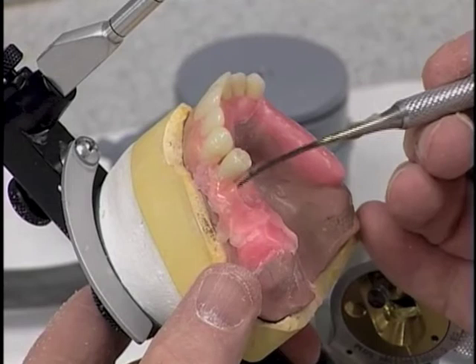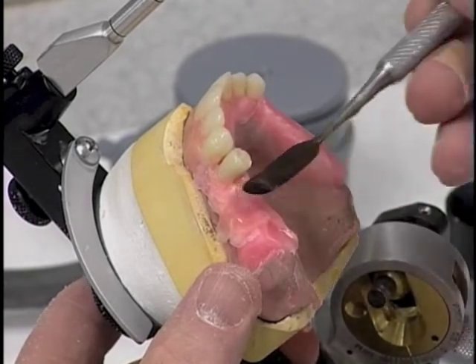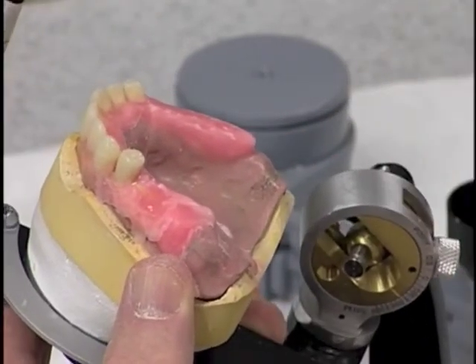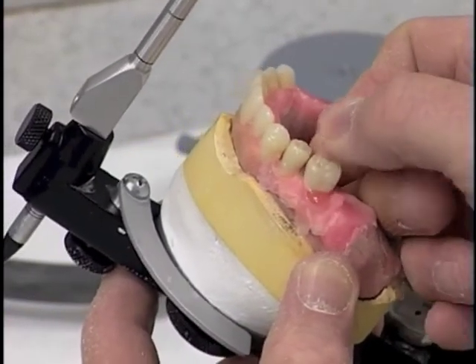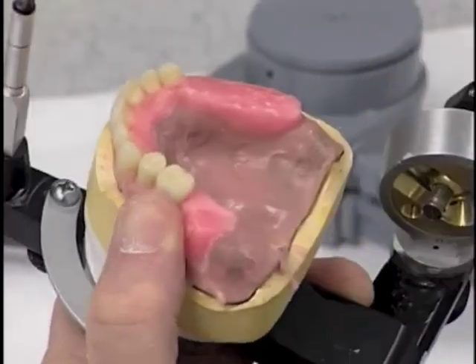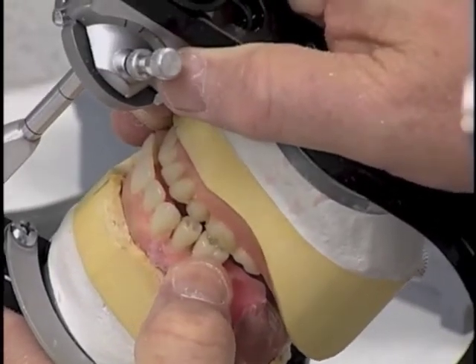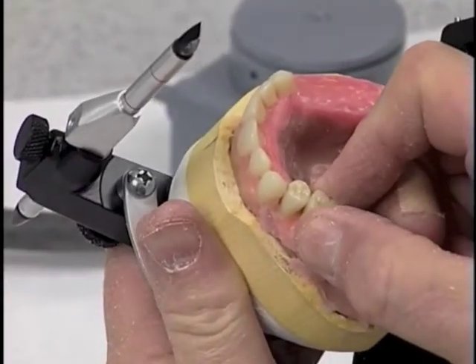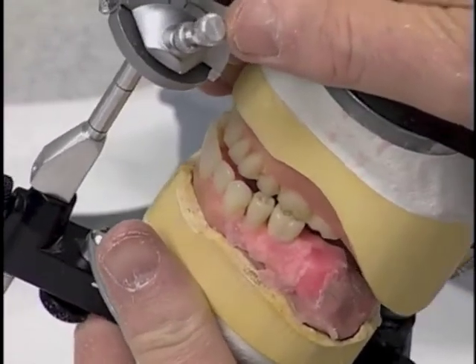So now we're going to pull the wax again in the area of the first molar. We need to add just a little extra wax here, just right in that area. And now we're going to put that first molar, as it has been trimmed, into it, and hopefully we have enough room to place the tooth without interference. And that seems to fit in quite well now.